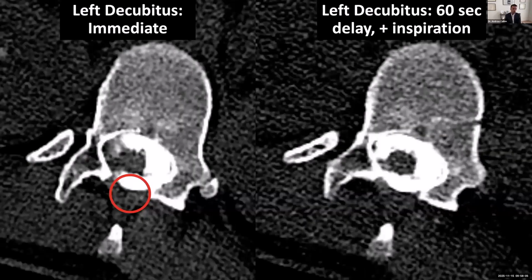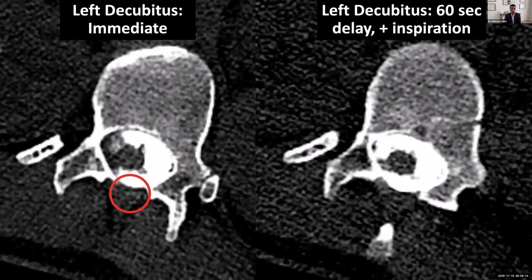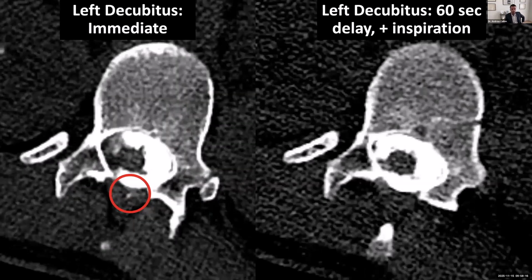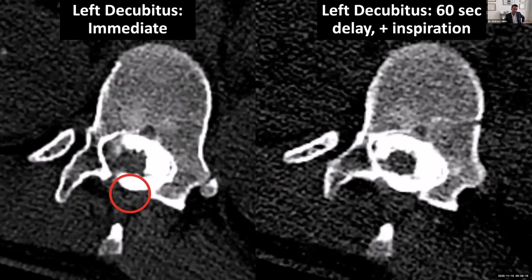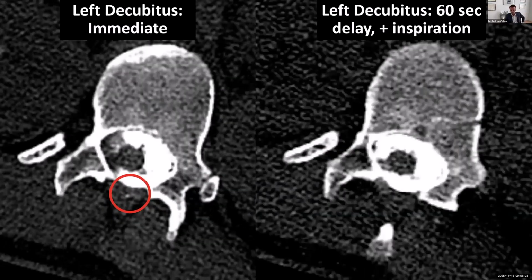I had this very, very unusual case. I actually showed many of my colleagues. I didn't know what to think of this, but this patient who had many years of orthostatic headache on their immediate run actually had this very small, subtle serpiginous opacification arising from the dorsal dura at T12-L1 that on their immediate phase was visible.